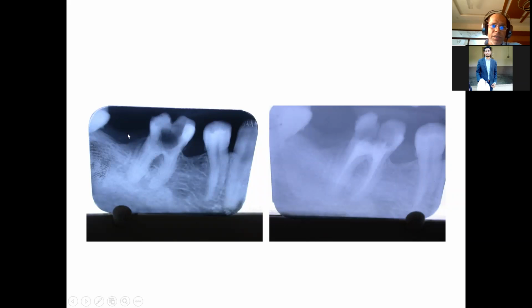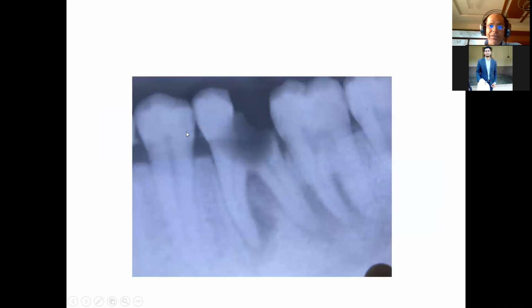Okay. Sometimes with a deeply carious tooth structure, again the prognosis is questionable. Here you can see a very deep carious lesion involving the furcation or the floor of the pulp chamber, or a very thin furcation floor, where the pulp chamber is very thin and could be perforated, with bone loss at the periapical area, and the coronal tooth structure is so much lost.